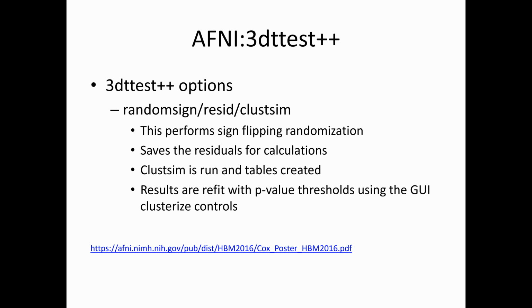So it has the ClusSim feature, which, here we talked about the autocorrelation function earlier, that we were looking at noise in our data. Where you acquire that noise in your data when you're just going through your data analysis is through the error time series.